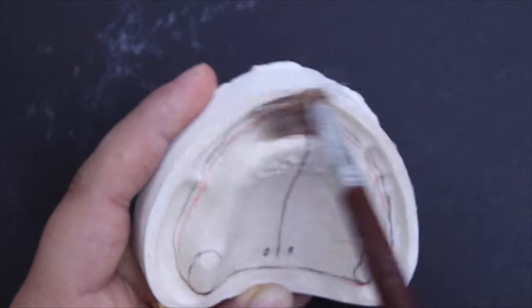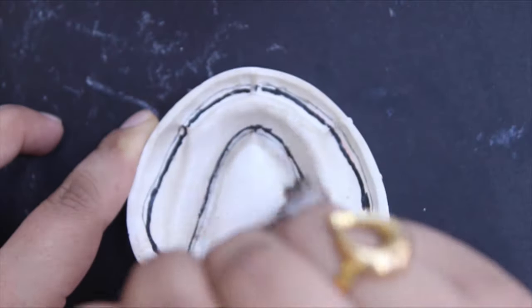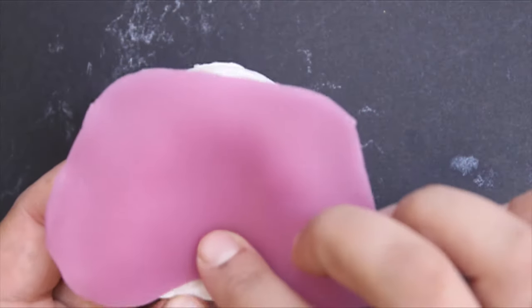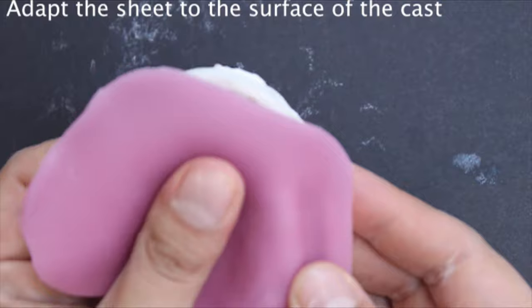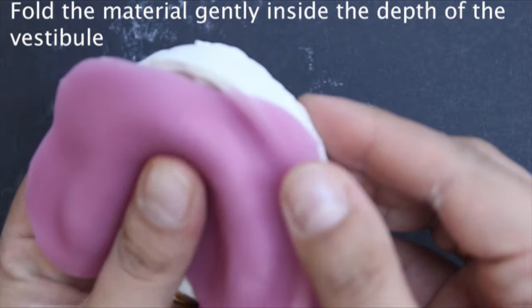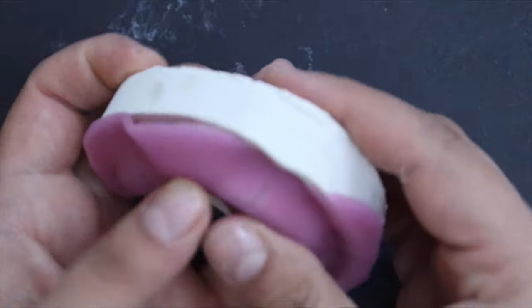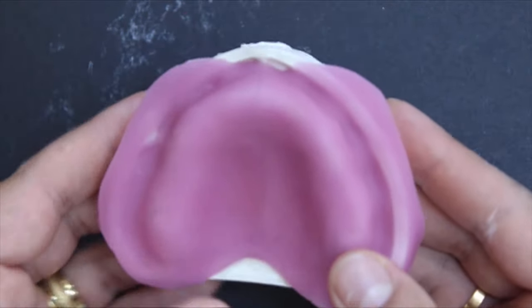To start making the custom tray, coat the surface of the cast with a thin film of vaseline. Get a sheet of light-cured acrylic and adapt it to the surface of the cast starting from the center in an outward direction. Fold the material gently into the full depth of the sulcus to make sure the sheet is closely adapted and air is not trapped beneath the surface.